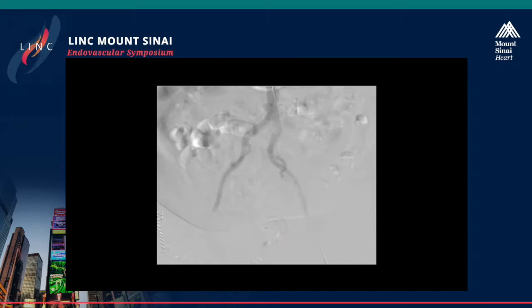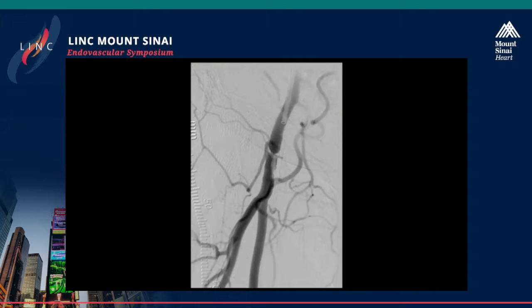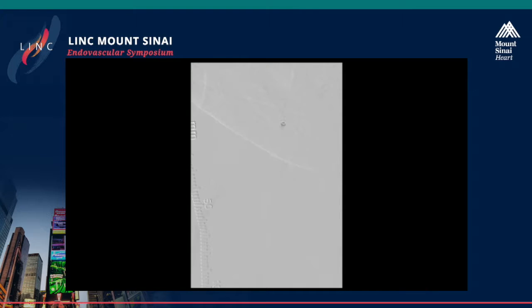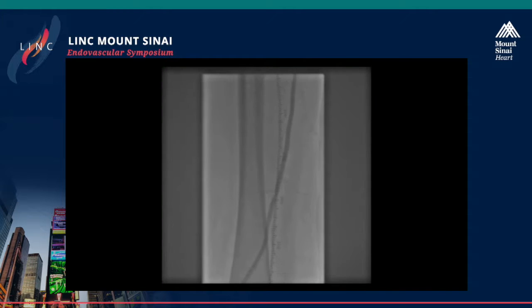So here's the angiogram. You can see the iliac system is without significant disease. Next slide. You can see there is significant disease at the common femoral that PK will talk about further, but there may be some dissection or thrombus in that area. Next slide. And of note, the patient denies previously having any groin procedures such as a cardiac catheterization or anything else. Here you can see the SFA has just some mild disease, and at the level of the popliteal there is no significant disease.